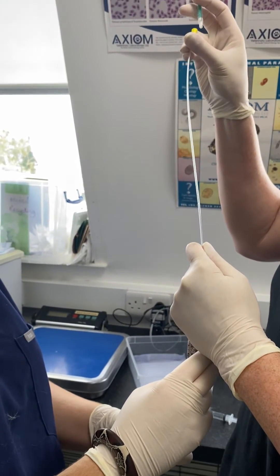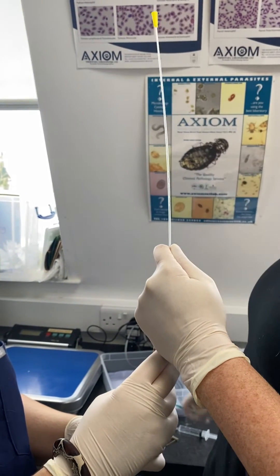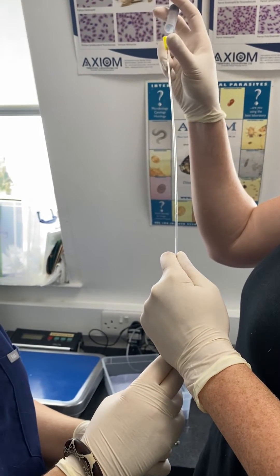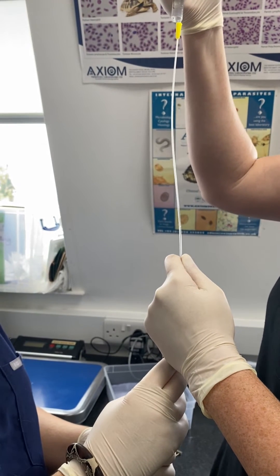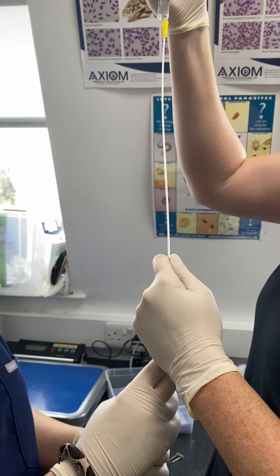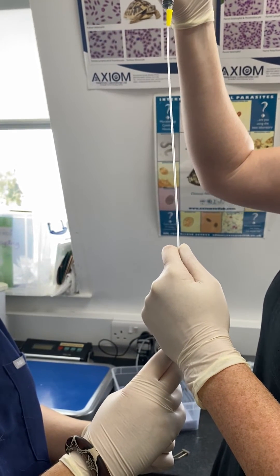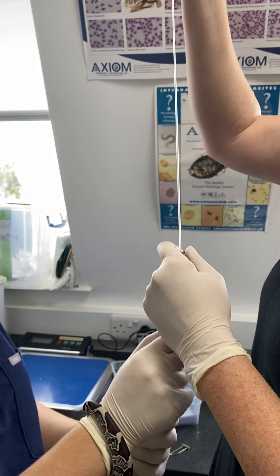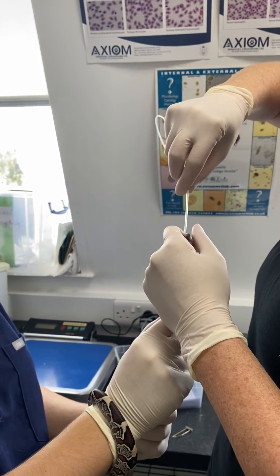We then have our medication that we're going to pop into the tube and flush it down afterwards with a little bit of water. I'm just gently supporting the snake — not restraining it excessively. Pop all of this down until it's flushed nice and clear, and we're going to hold this snake vertically and then just gently withdraw this urinary catheter up and out of its mouth.